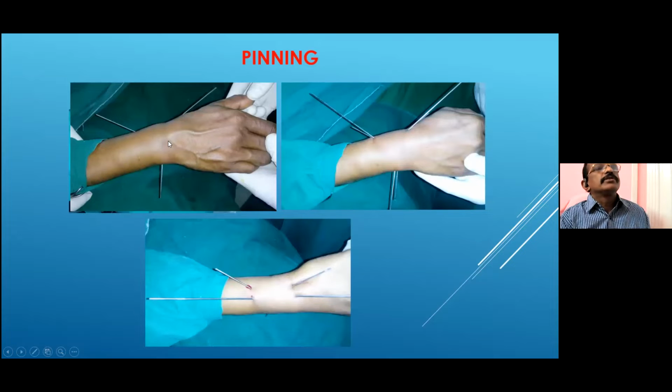These are the orientations. In the first picture, the first triangle is created. Second is the second wire, and you can see the orientation of the wire in the plane. The third picture shows the different planes for the fixation of the two triangles.